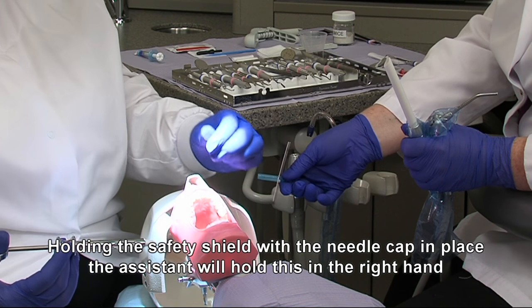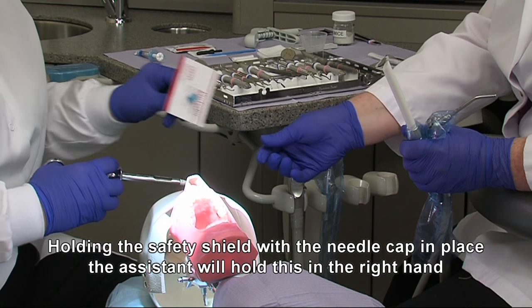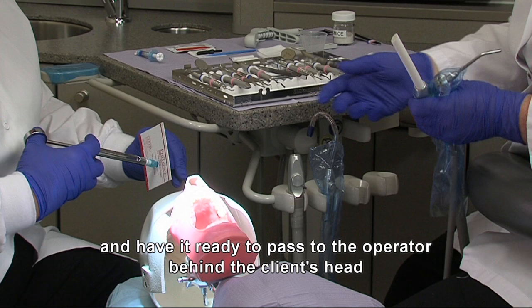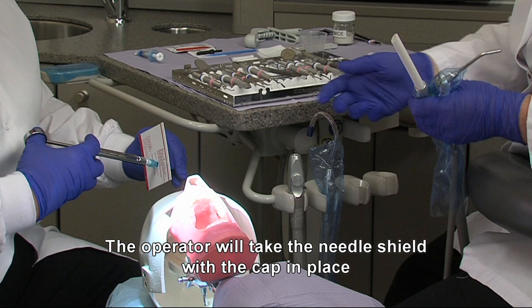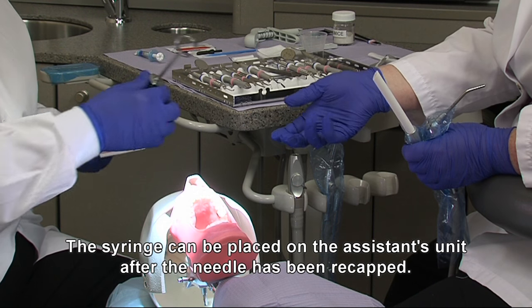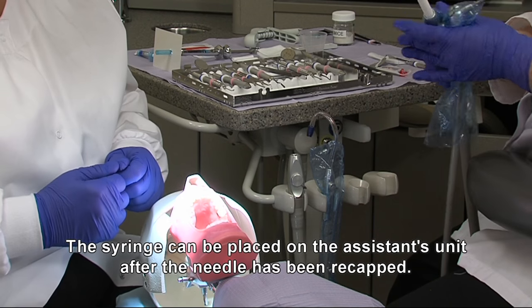Holding the safety shield with the needle cap in place, the assistant will hold this in the right hand and have this ready to pass to the operator behind the client's head when the operator has finished with the injection. The operator will take the needle shield with the cap in place, and the operator will be responsible to recap the needle. The syringe can be placed on the assistant's unit after the needle has been recapped.